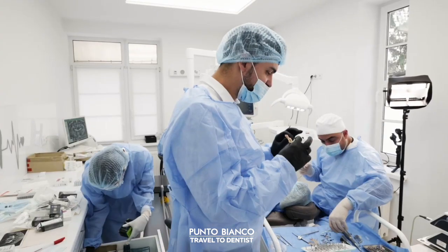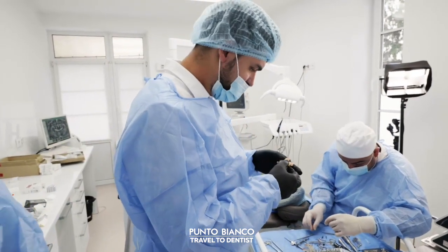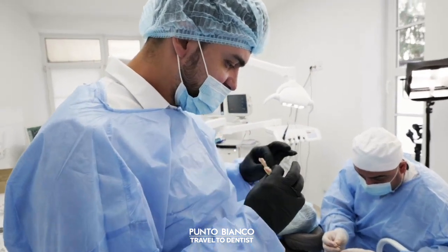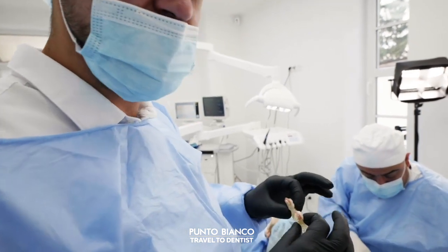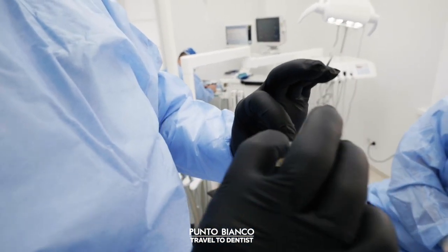Without this positioning, it would be impossible to check or at least more complicated, and we would believe that in the end we would throw away the prosthesis and go with the standard protocol. Here we're still pretty confident that it'll turn out well in the end.